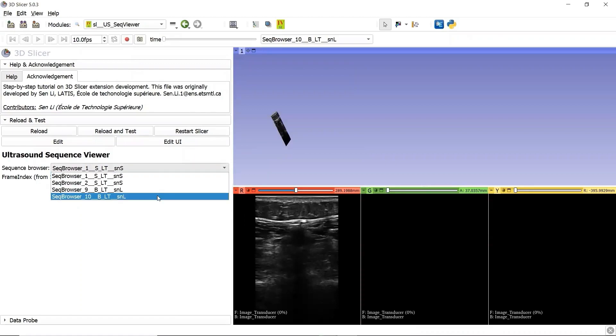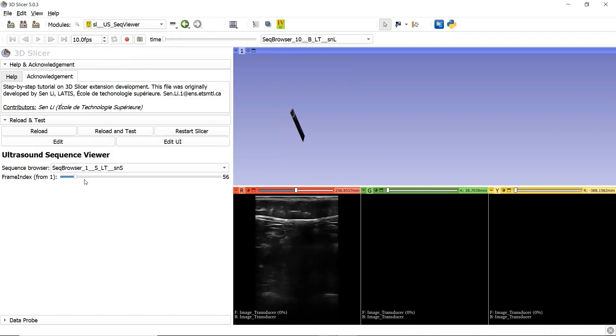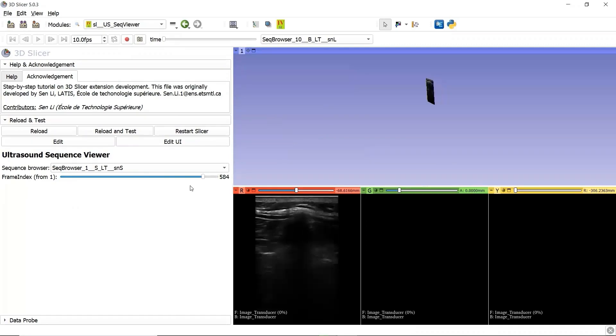In the Sequence Browser drop-down list, we can select the different Sequence Browser nodes. We are currently at Sequence Browser 1. The slider under the drop-down list helps us view the recorded ultrasound sequence, image by image, and step by step. And we can always see the current frame index from here.